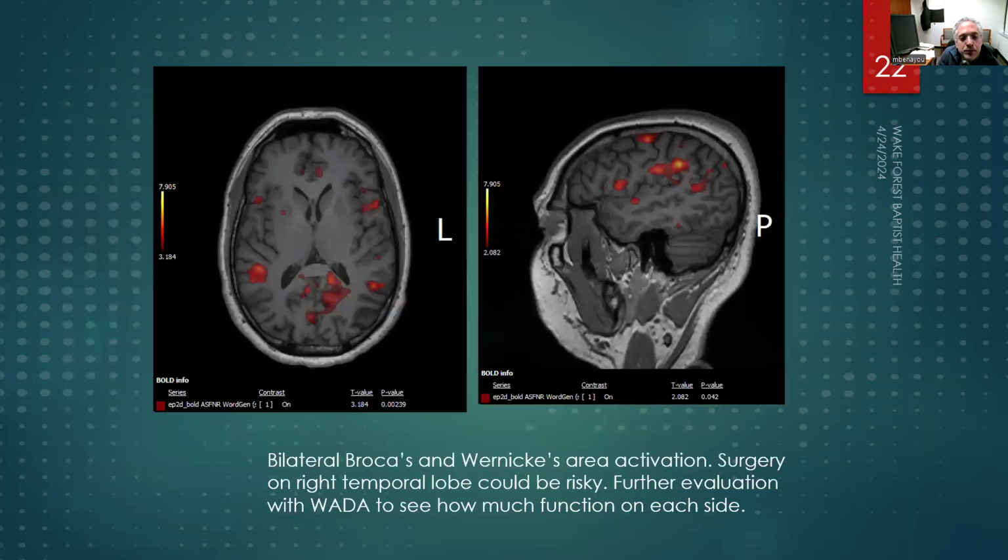So this, though, is typically what the fMRI results look like. What we've done here, we talked a little bit about finding those voxels that look like they likely correlate with the task paradigm. So these are going to be those ones that have a beta coefficient that's not 0, saying that the BOLD signal in that voxel looked like the ideal waveform, or the ideal time series, that we would have expected for a voxel that's participating in the square wave task paradigm.